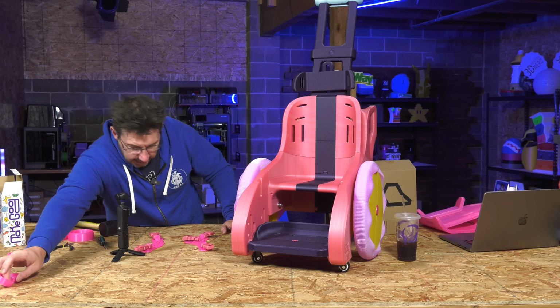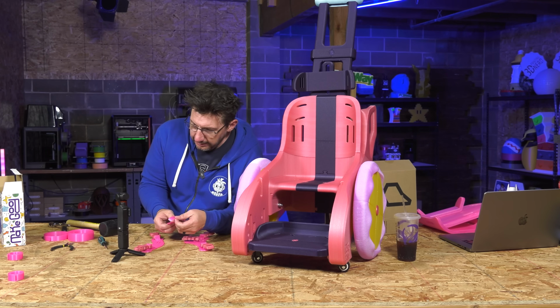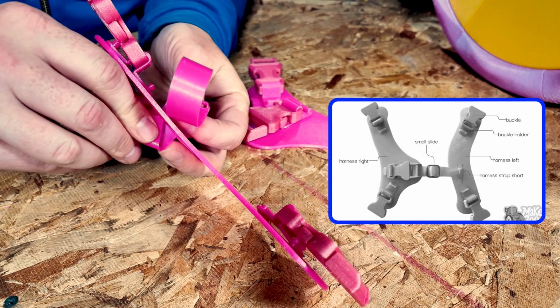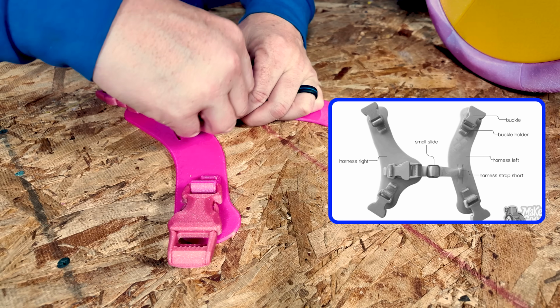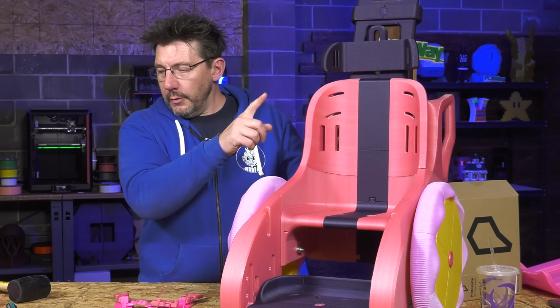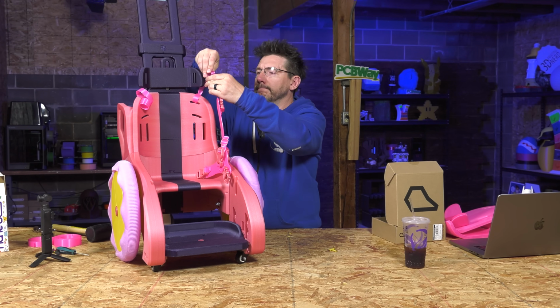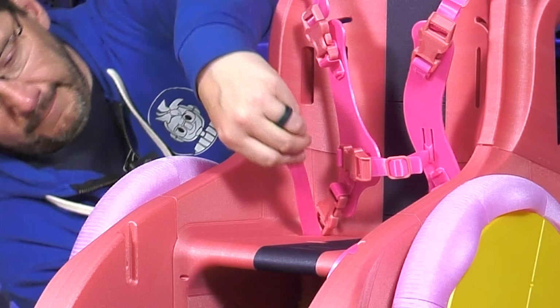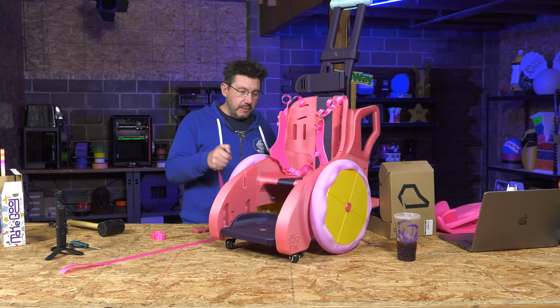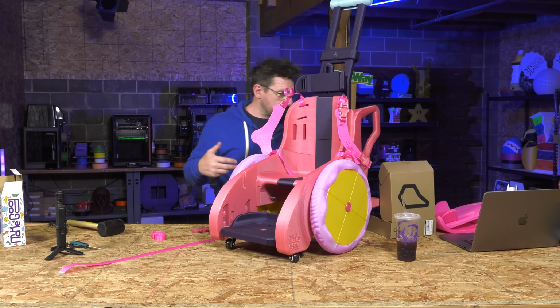And there we go. This is gonna be a strap, and I believe it is. So these straps have a little hole in one side that this goes through. Let me show you. So if I feed it through here and then back up, so this would go like that on the kid to keep them safe. Now we put some straps on the chair. And the one that is shorter is gonna be the seat belt. That is fed through the same holes in the back, and it comes out, and that's how it's done, which is nice.